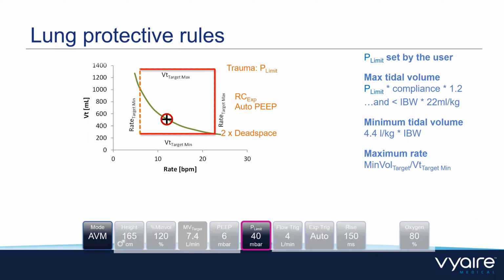And this is also constantly changing on the lung condition of the patient. So it's not a fixed value, which tells you, okay, the respiratory rate can't go beyond 25. It's always moving. It's always changing with the condition of the patient. And last but not least, there's also apnea.